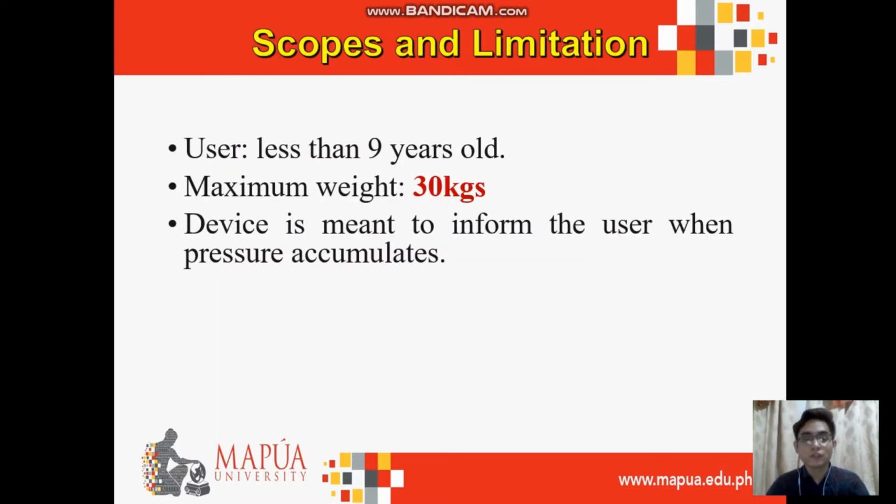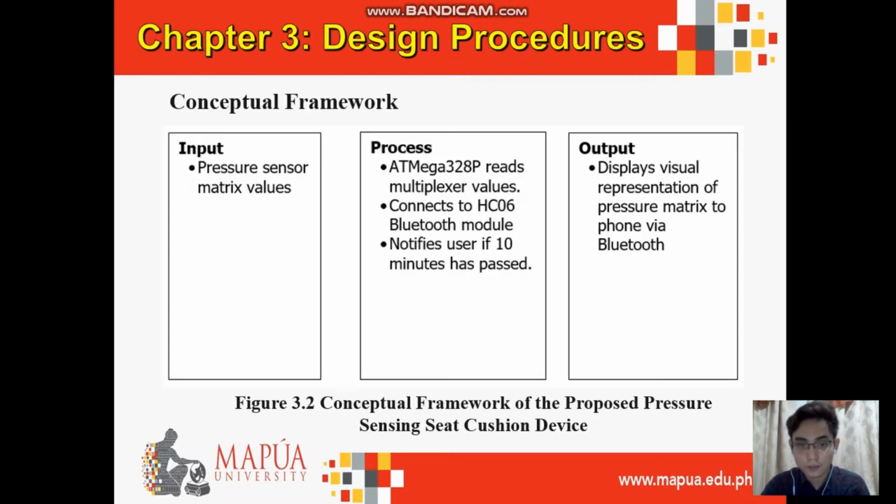Scopes and limitations: the user must be less than 9 years old and must weigh less than 30 kilograms, and the device is meant to inform the user when pressure accumulates. Next we have the conceptual framework.